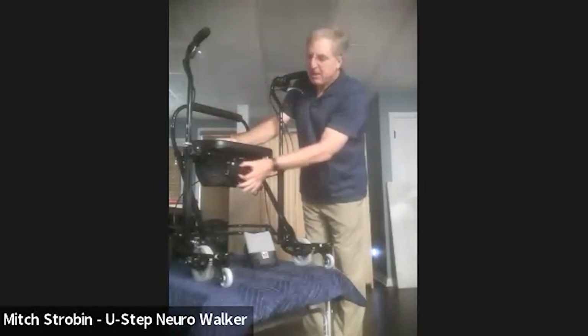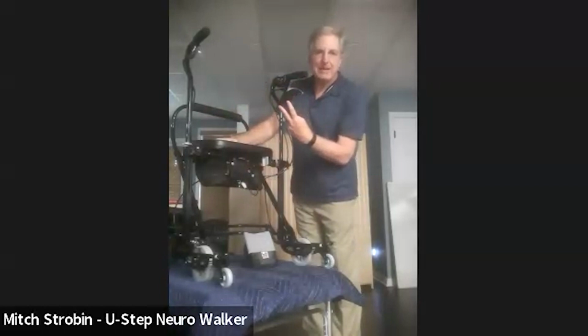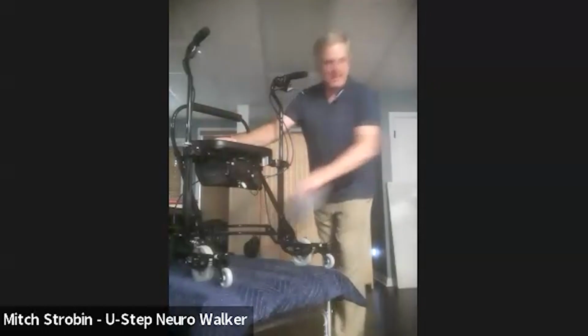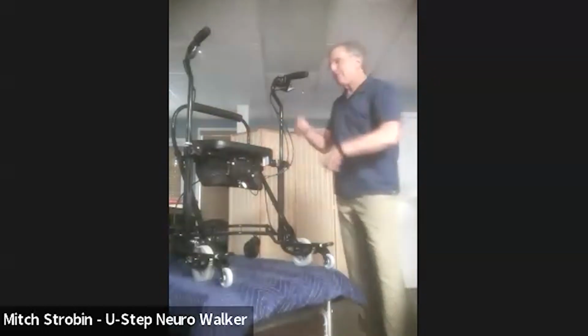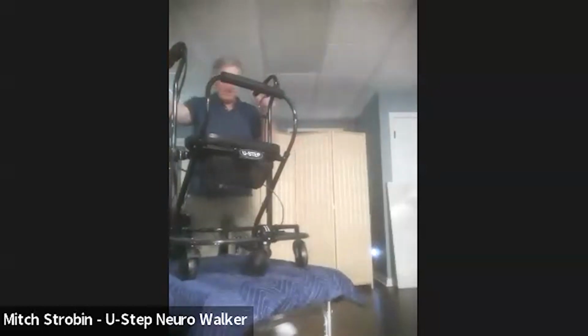Okay, but I'm not trying to sell here today. This is education. So one more thing related to the laser and the metronome. We have the seat here. Beneath the seat, you'll see a small black rectangle box with one red hand screw. That's the battery compartment. 2 AA batteries, that's all it is for the laser and the metronome. So if the laser stops working, just change the batteries. Very, very easy. Okay. So I'm gonna flip this on the table and show one more thing. Then we're gonna get off the table and have more fun.